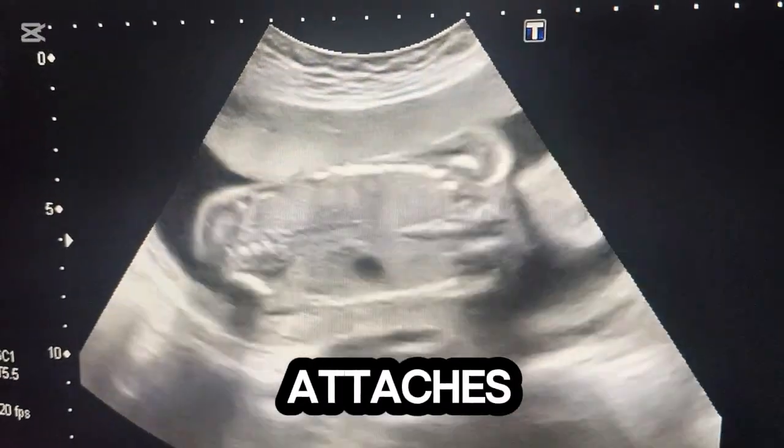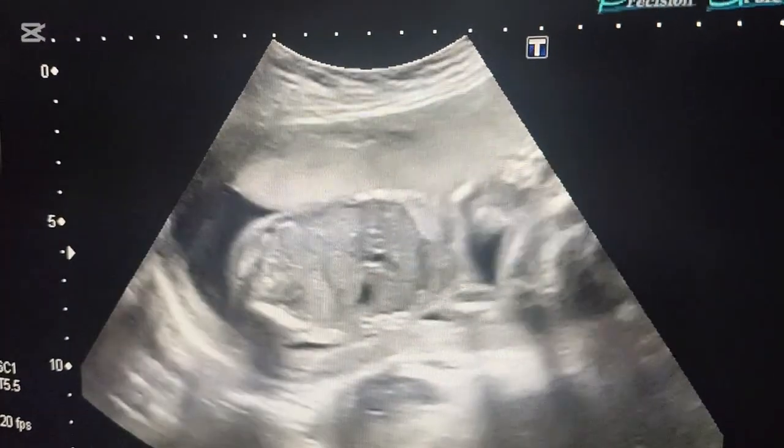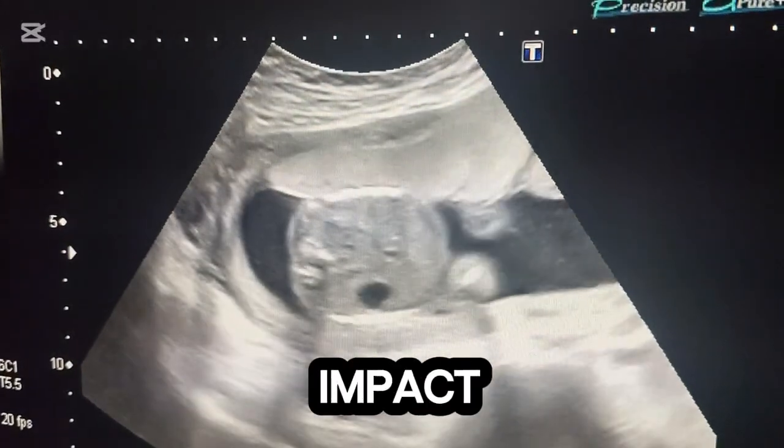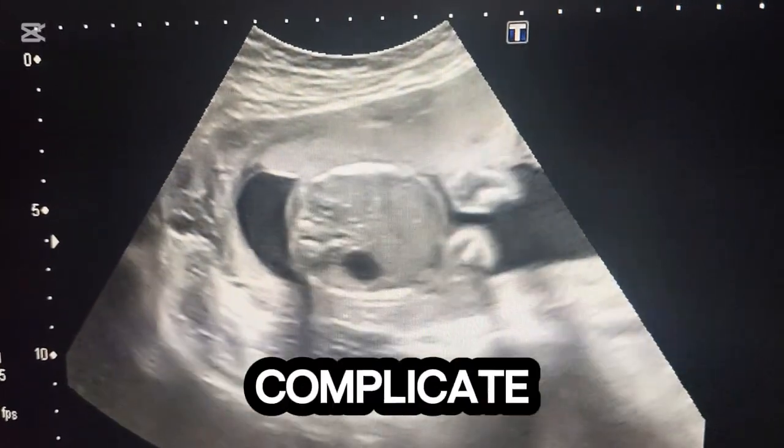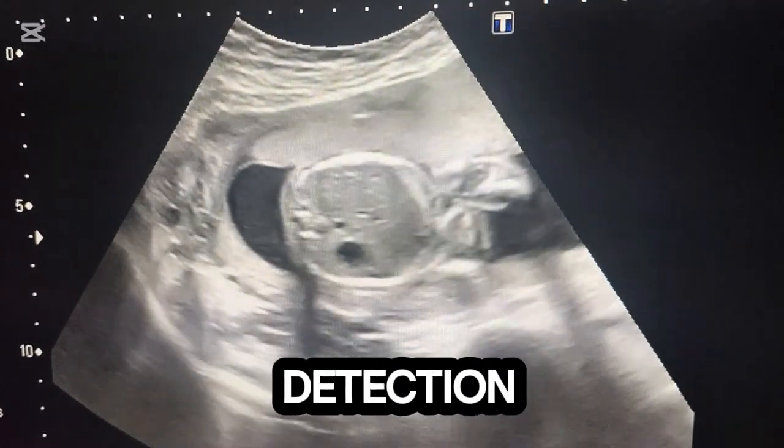Anterior placenta attaches to the front uterine wall. It usually has no adverse impact, though it may slightly cushion fetal movements or complicate early heartbeat detection.